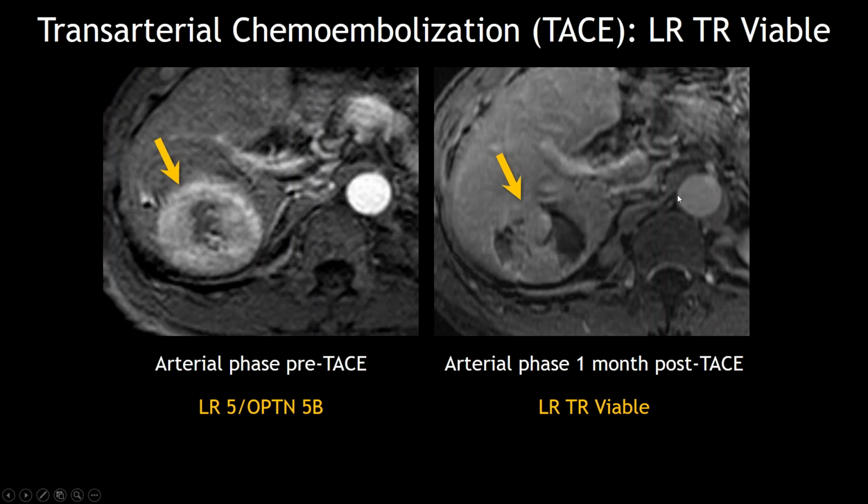So even if this was the right phase here, the whole thing should be basically black. There should be no enhancement whatsoever, whether it's hyper enhancing or just iso enhancing or even hypo enhancing. There is still enhancement is the point. And so that presence of enhancement, again, whether it's hyper enhancing, iso enhancing, or hypo enhancing, is suggestive of viable tissue. I see. But sticking to the criteria of LI-RADS post-treatment, it should be either hyper enhancing or washout or enhancement like the pre-treatment tumor. This does not fulfill one of these criteria, so maybe equivocal.